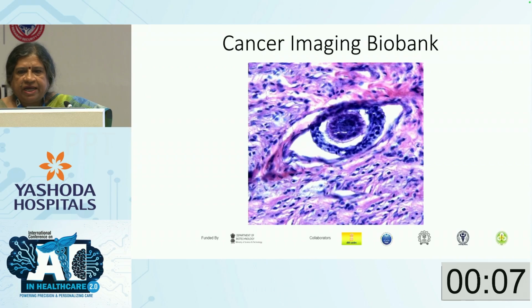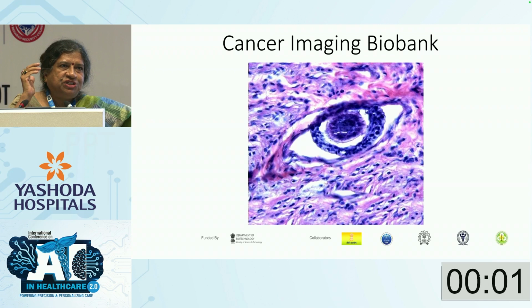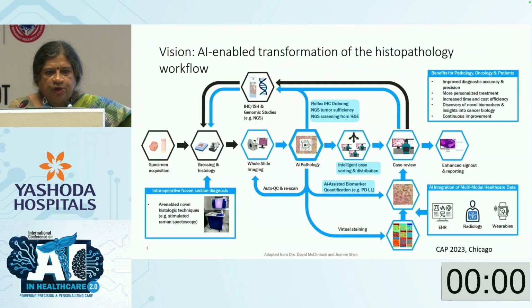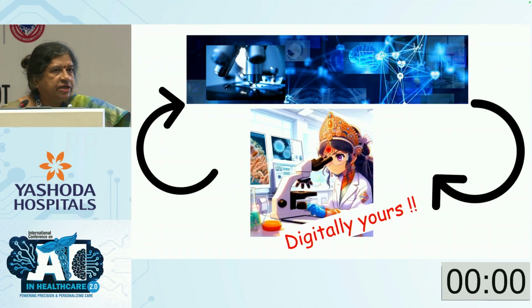Coming to cancer imaging biobank, many of the limitations which were discussed in the previous talks can be dealt with by cancer imaging biobanks, and this is the AI-enabled transformation of the histopath workflow right from receipt of the sample to final sign out. Thank you very much for your patient hearing.